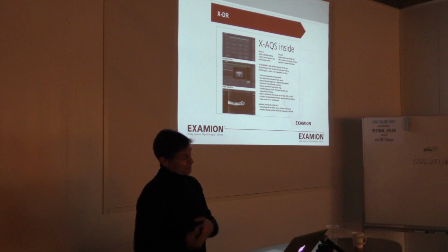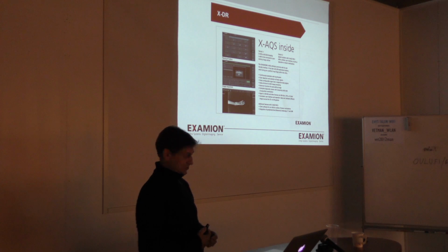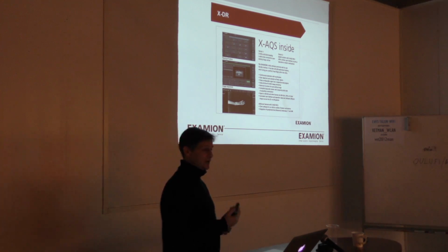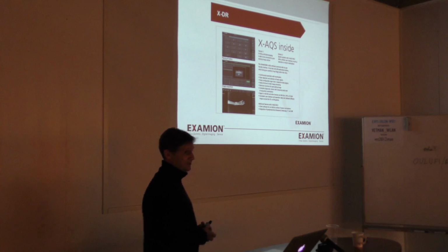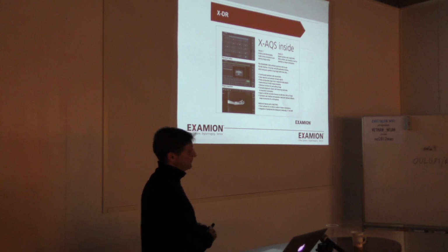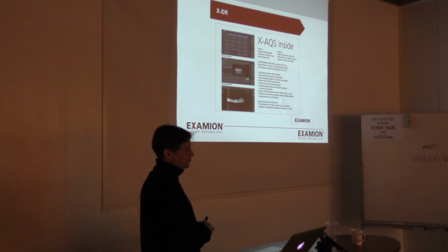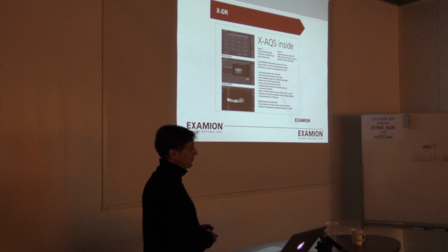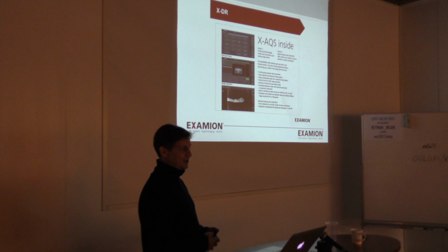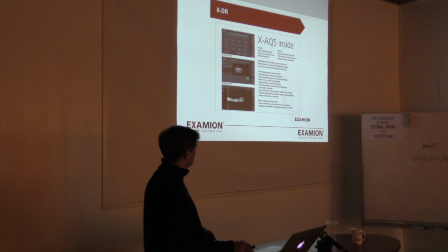In the human field, this is more important than in veterinary, because in larger clinics most of the mistakes are made by losing pictures through entering wrong patient and wrong owner data. Even a typing failure or just a deviation can be sufficient for some data to get lost, not to be found again. So if you don't have to retype it, you minimize data failure, plus the workflow in your clinic becomes much easier. Losing time sitting typing, sometimes the typing can take longer than actually taking the X-ray. So again, better to focus on the animal.